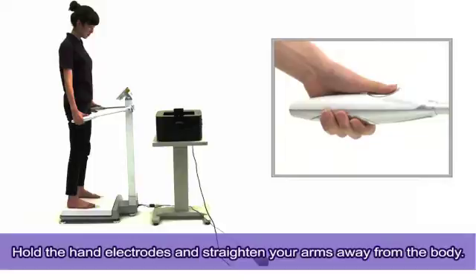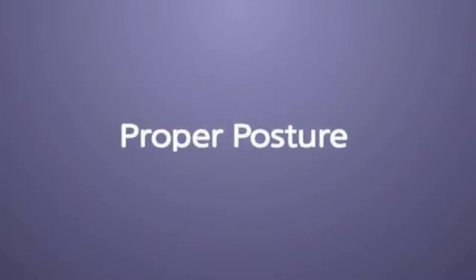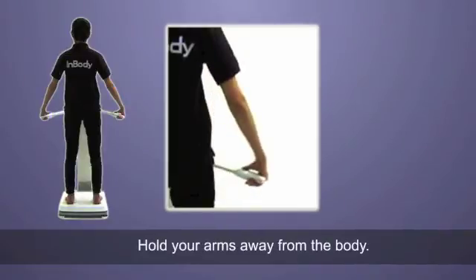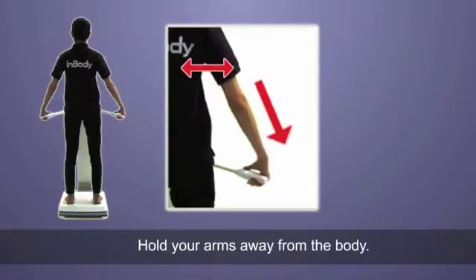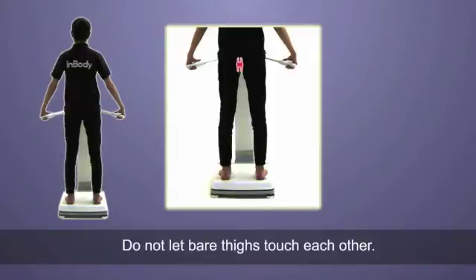Hold the hand electrodes and straighten your arms away from the body. This should be the proper posture. Keep both arms straight. Hold your arms away from the body. Do not let bare thighs touch each other.